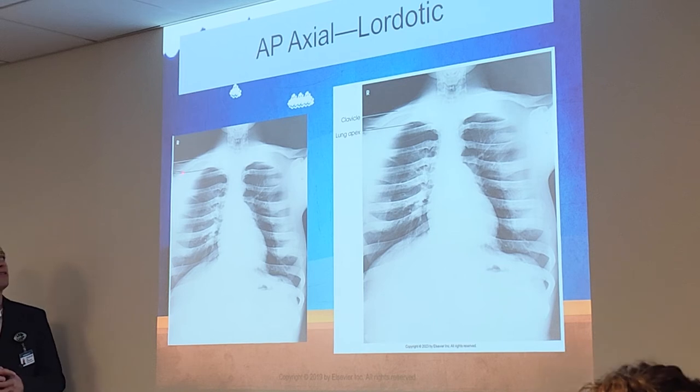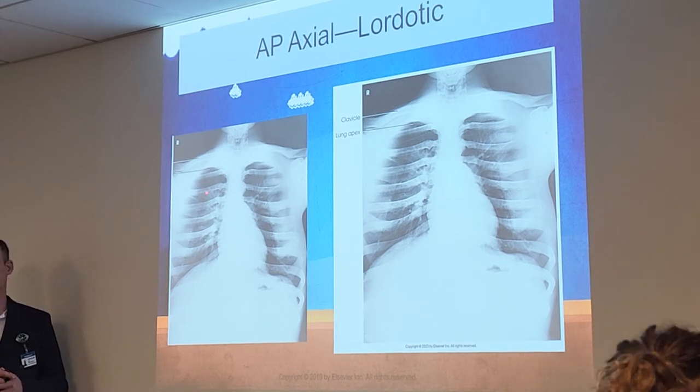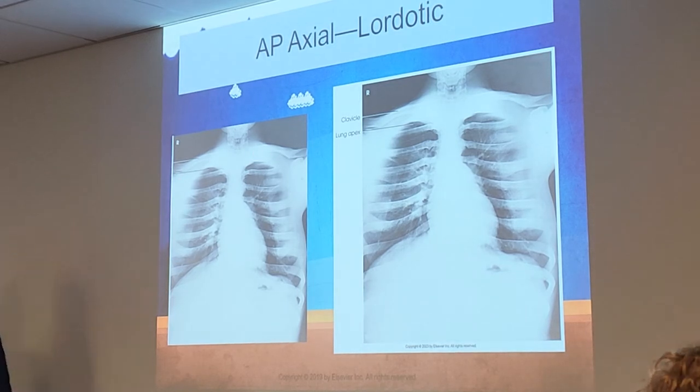You'll see how also the clavicles are more horizontal shaped once again. You got less curve to them. That nice straight line, well, almost straight line. And what was the alternative name to lordotic? What's the method name? Lindblom.